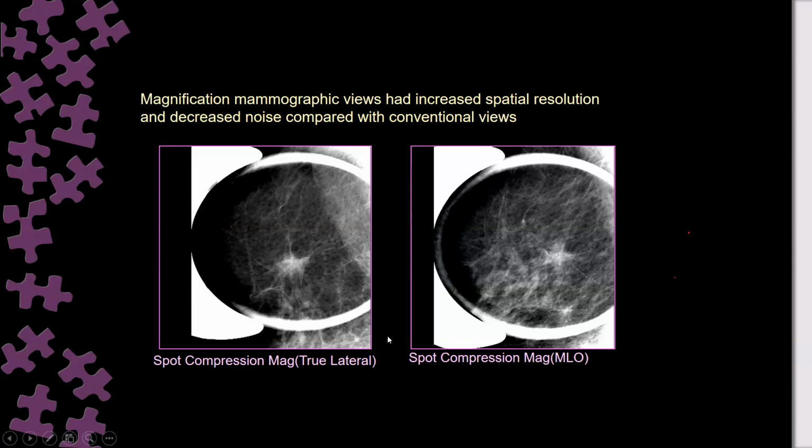You see, we discussed before, when the lesion is close to the image receptor, it will be more clear.